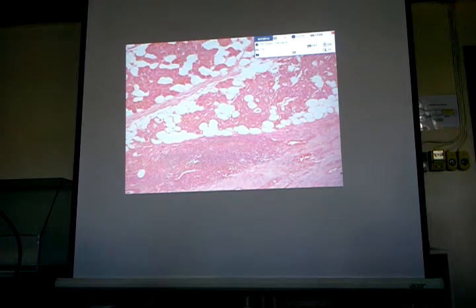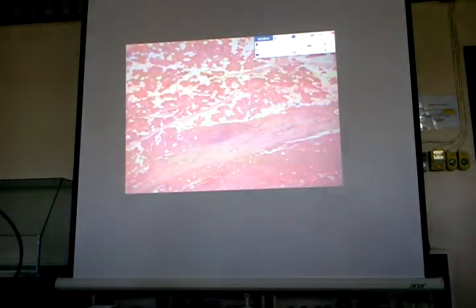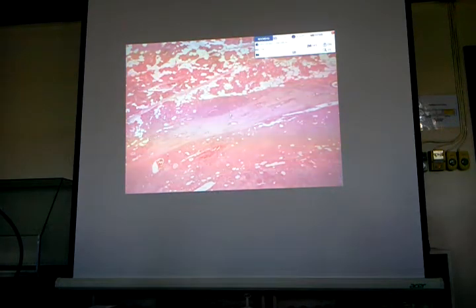Inter or intra? Intralobular duct. And then, how do you call those pointed cells? Are they abnormal in the salivary glands? Okay, so regular ang presence ng, anong cells yun? Adipose cells. Now, the problem with this parotid gland is that a mass which is well circumscribed, that's the fibrous capsule of the mass, is present, separating the normal salivary gland tissue from the tumor.